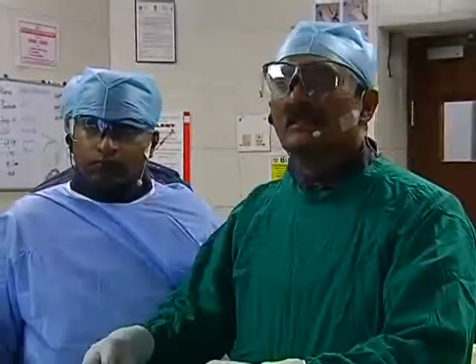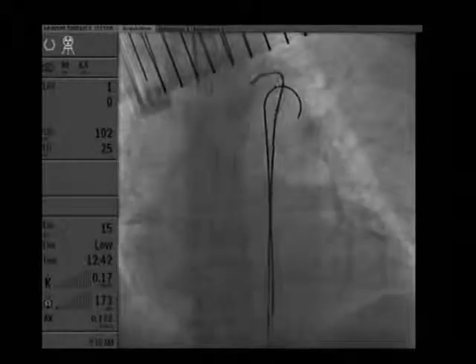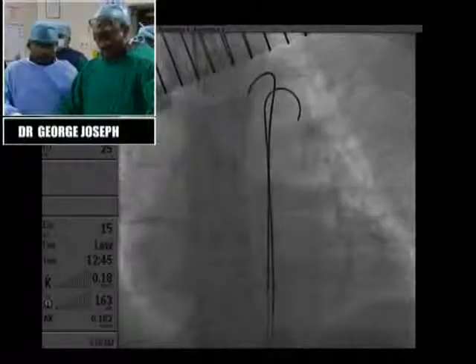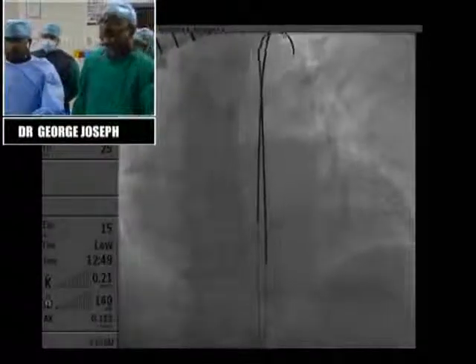Yeah, if all fails, then you need to come from a brachial or radial approach, and that usually works. So we have now another stiff wire going up the left side through the contra gate, and both these wires are backup Meier wires from Boston Scientific. I like these. They're really supportive wires and they don't tend to kink as much as some of the other wires.